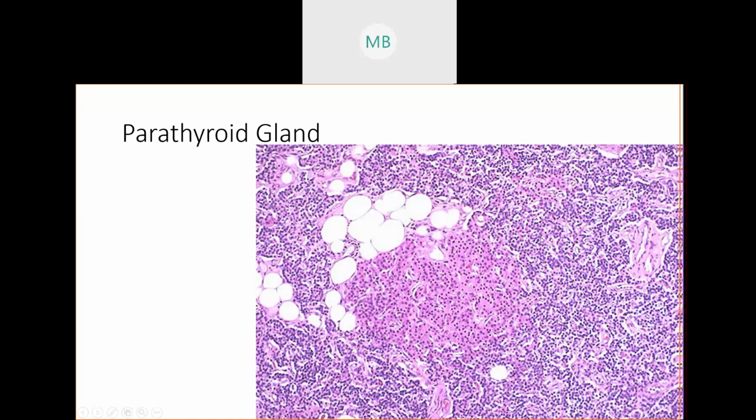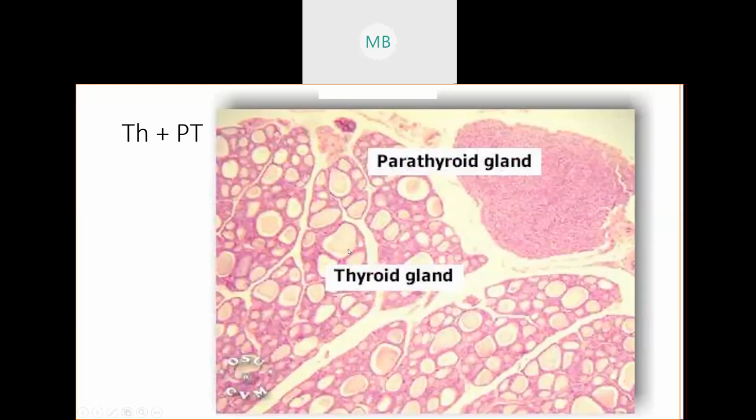You know you're looking at your parathyroid because you know you're in the vicinity of your thyroid because of those bubbles. So you are identifying parathyroid at first glance by its proximity to what you can easily identify as the thyroid. Once again, in the thyroid gland you have the bubbles all throughout here, but this corner right here is the parathyroid gland. So it's distinctly cut from the thyroid. There's some space here for connective tissue, and you have the parathyroid gland immediately here. You can identify this part as thyroid pretty easily. Parathyroid, here we go.